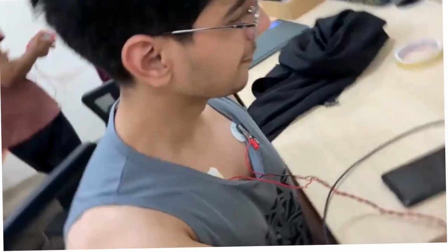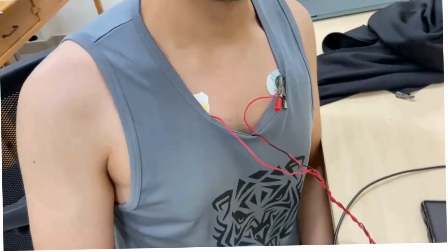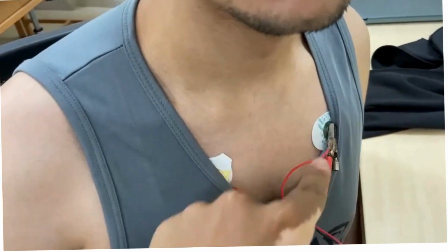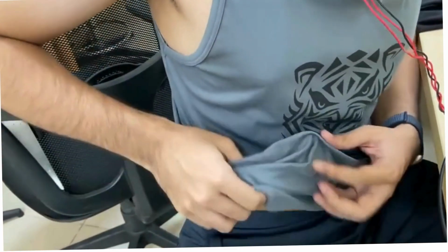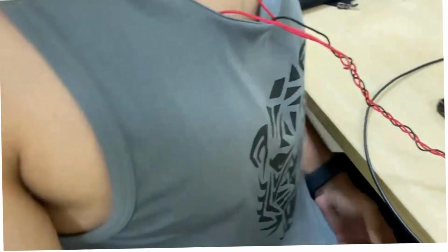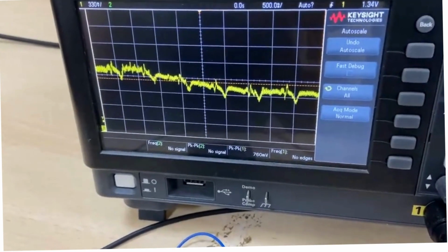This is our patient, right? Here, essentially what we do is that we connect the ECG leads, right? One is put right over here and the other is put right over here. We provide a grounding condition right there, which in turn will give us the ECG outputs that we require. This can be seen in the wave output.